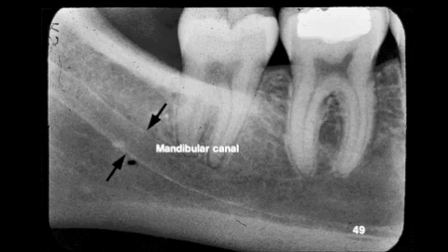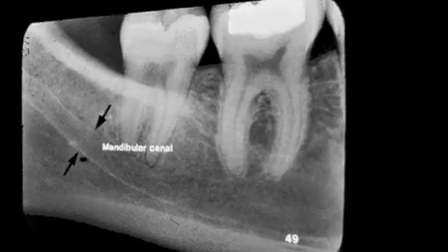Between these arrows is the mandibular canal. It is radiolucent, with a white outline because it is surrounded by hard, compact, cortical bone. Above the arrows, we see a bright white landmark — the external oblique line or ridge, which we have observed previously. Below the mandibular canal is the lower border of the mandible, which is radiopaque and also observed on the slide.